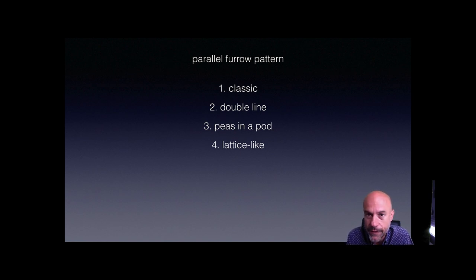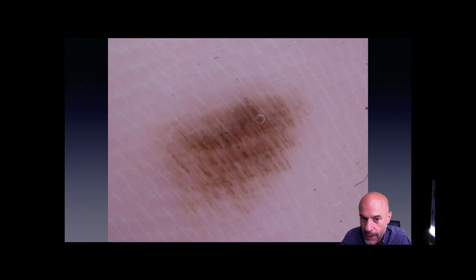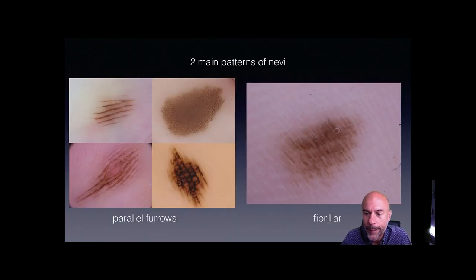This is the parallel furrow pattern with its variations. There is one additional dermatoscopic pattern on acral sites, also associated with nevi — it's usually benign. Here there are parallel brown lines, but they don't follow the direction of the furrows and ridges; they are perpendicular to the furrows and ridges. This is the so-called fibrillar pattern. The reason we see the fibrillar pattern is essentially mechanical pressure — we see it on moles located in areas of the sole where there is a lot of physical pressure. These are the two main patterns of nevi: parallel furrow with variations, and fibrillar.